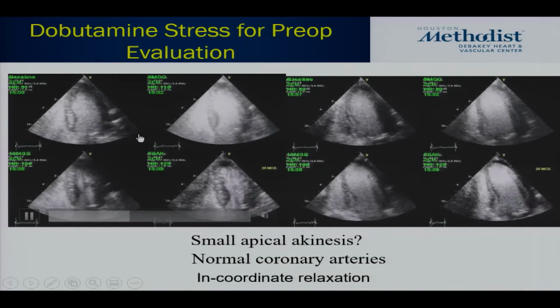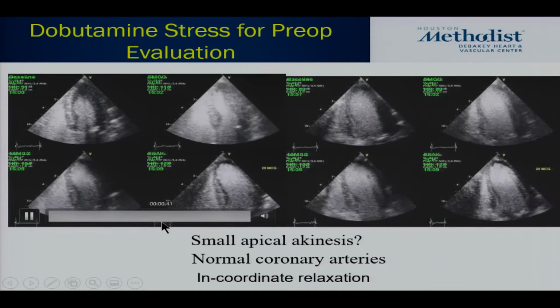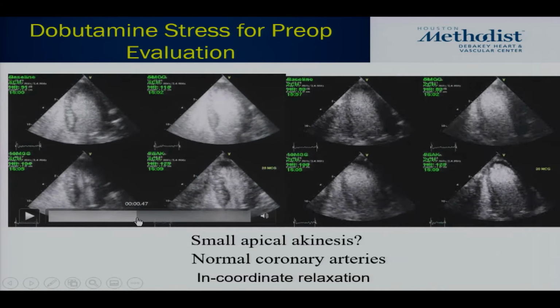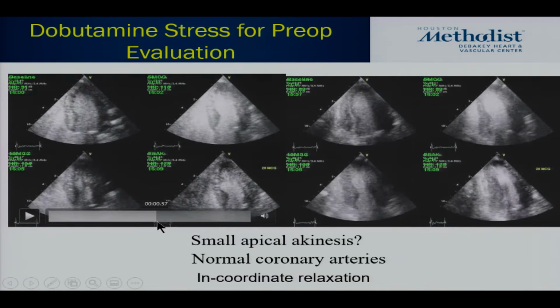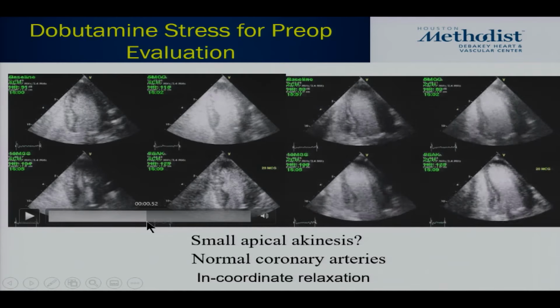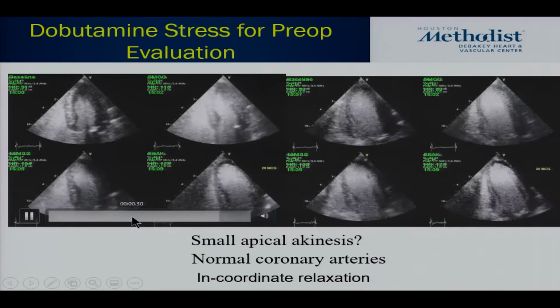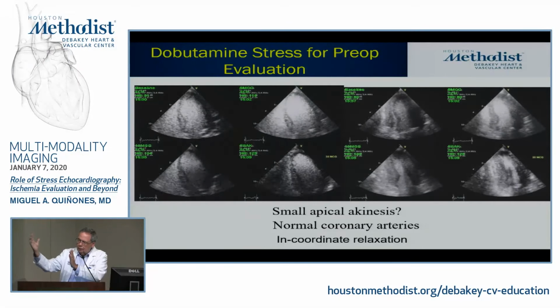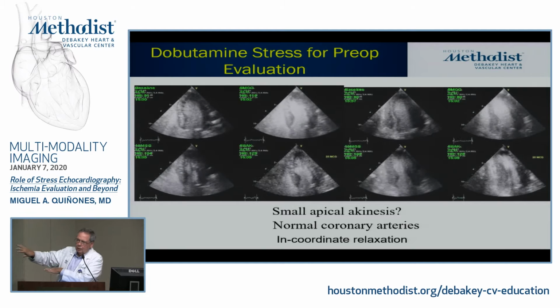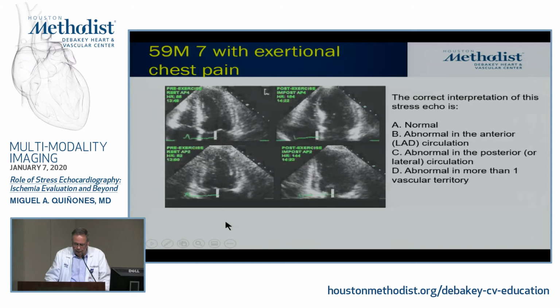So this is the importance of, in the lab, we have the advantage of slowing down the image, going frame by frame. I didn't know we could do that. That's great. So I just hold it. Oh, nice. See there? You see it now, right there in diastole. This is diastole now. We have passed systole. This wasn't systole. And at end systole, actually, there was no problem. So one thing you can do in the lab is bring your time bar to the peak of the T wave and only see systole and have no diastole. Those are little tricks that we can do in the digital environment.